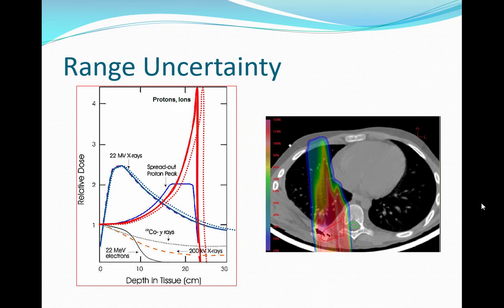And I've tried to show for each one of these, I've copied the curves and moved them, just so you can kind of see if I'm off, how bad does it change things, right? So I've displaced it to the side. Doesn't really make a big difference, right? A little horizontal shift doesn't make a lot of vertical. And that's true with pretty much all of them. Some of them you can't really even tell for a small shift. But for protons, you can tell, right? What I needed got a significantly lower dose and what shouldn't get anything got a huge dose. So we need to be accurate.